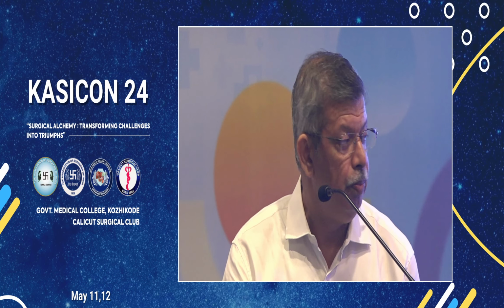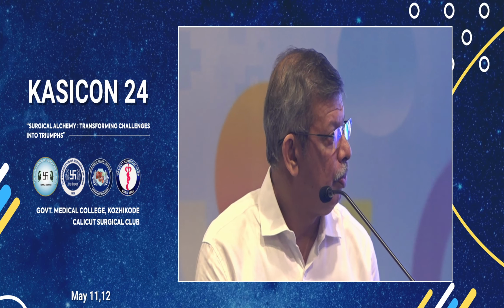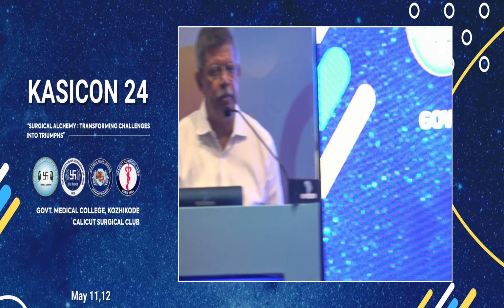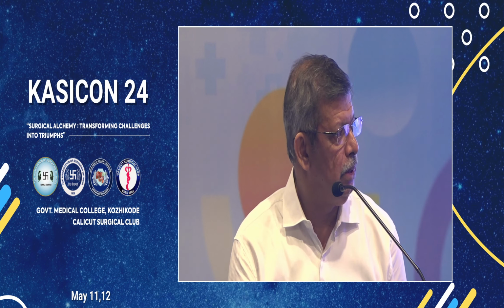So what technique will you use in geriatric surgery, open or closed technique? I always go for the open method. Only in situations where the area of the umbilicus cannot be accessed, for example, a patient who has an umbilical hernia, so we need to do an IPOM, the entry is from the epigastrium. In those cases, we'll be going for a Veress needle. So only in certain situations do we go for the Veress. Otherwise, it is by the open method.